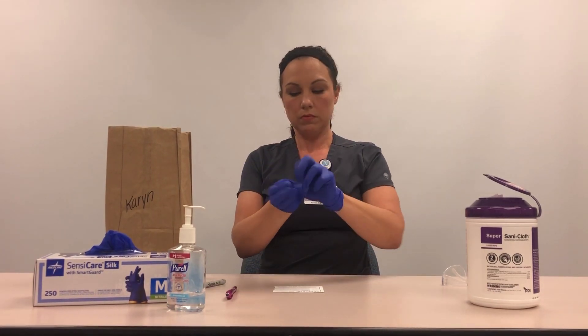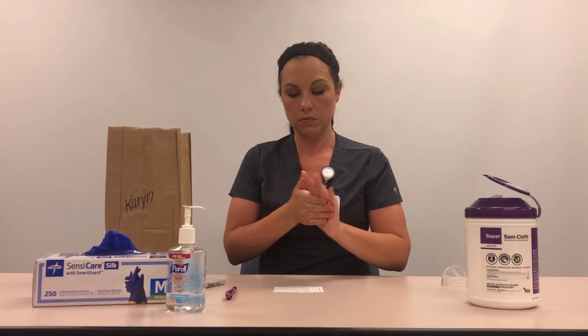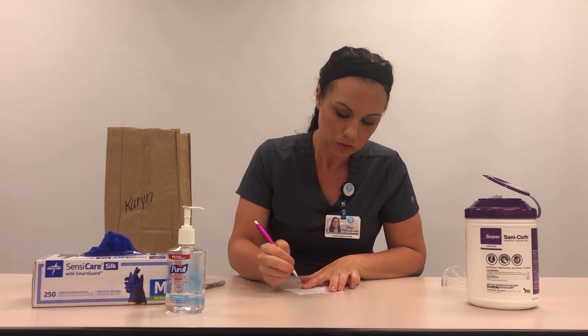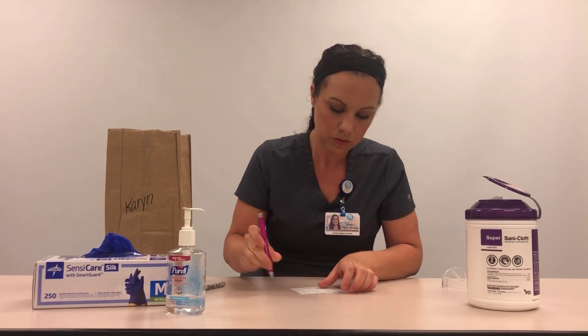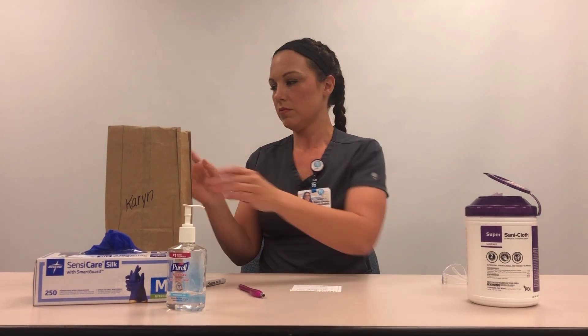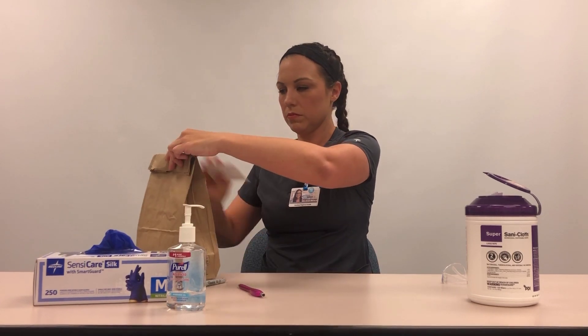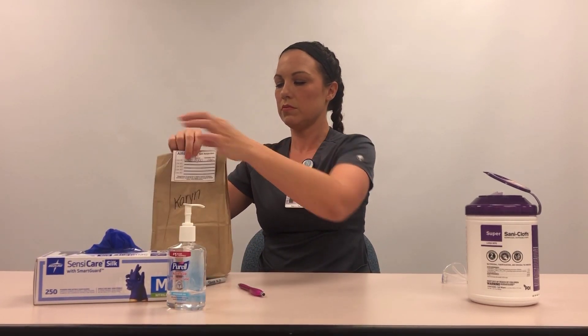Doff gloves and perform hand hygiene. Log the time off on the airborne N95 respirator bag tag. Then calculate and record the cumulative time worn. Paper clip the bag tag to the bag and store in the designated area within your department.